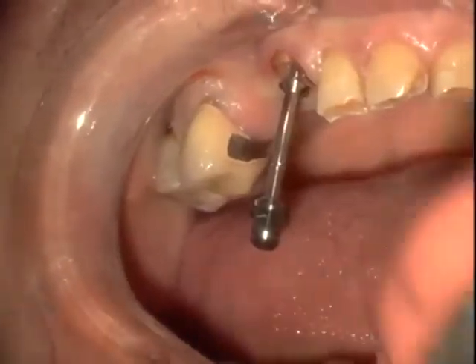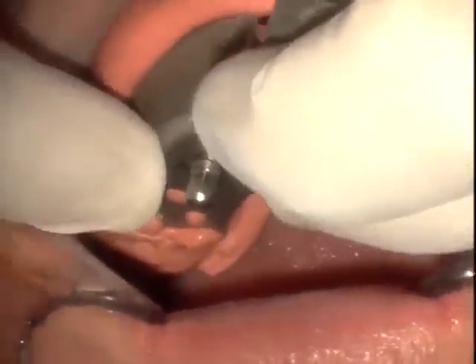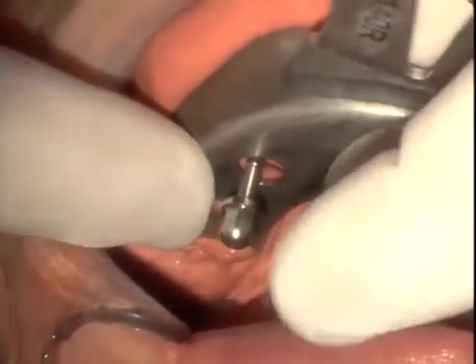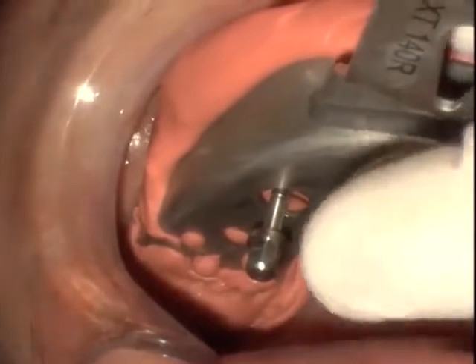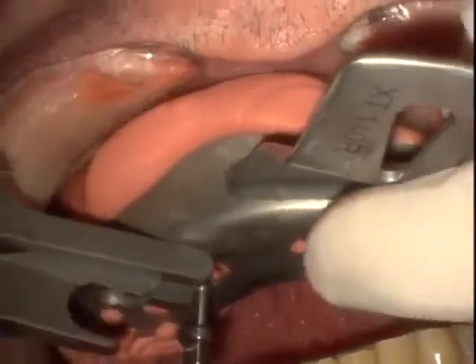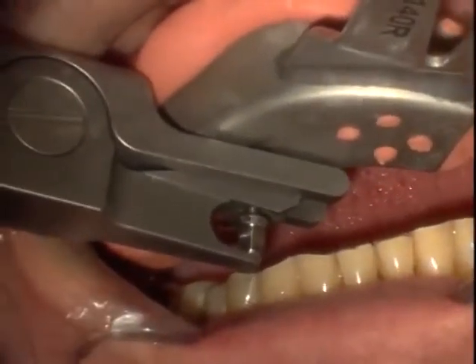You can see the placement of the putty impression to protect the adjacent teeth from any of the forces that are going to be placed upon the extraction screw. As we place down this putty matrix, you can see that little horizontal line is left exposed. This is very important in using this technique because once we place the extraction device, we really need to be able to have that clearance.